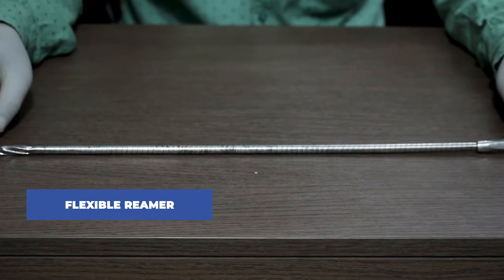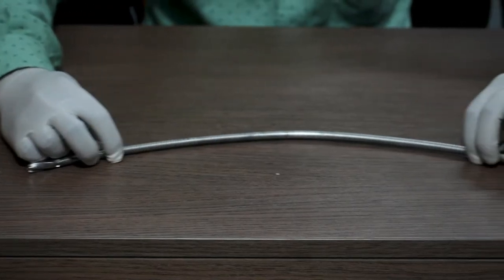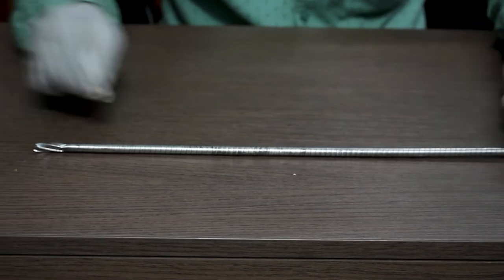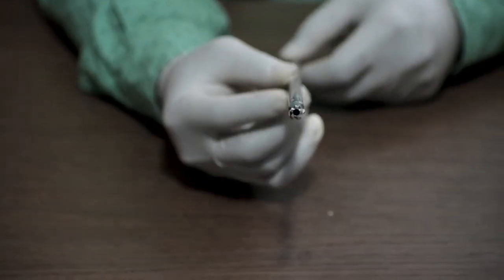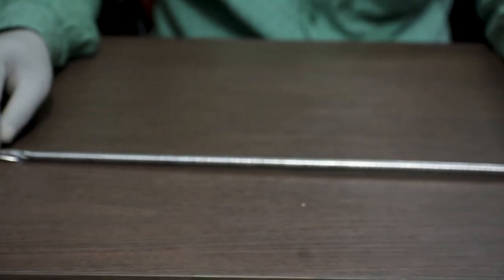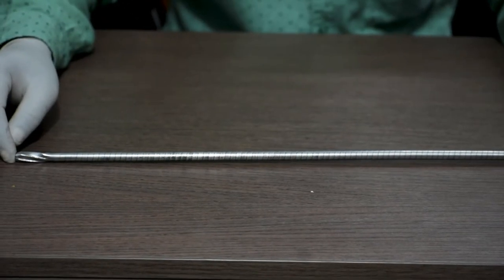This one is called a flexible reamer. This one also is cannulated. Available in the size of 8 mm to 12 mm, either with 0.5 gap in between or with 1 mm gap in between, depending upon the company.